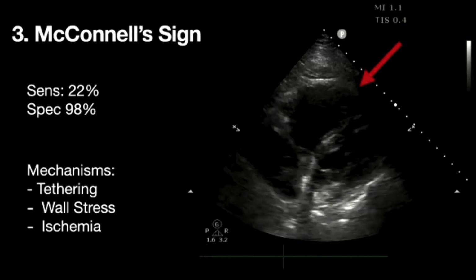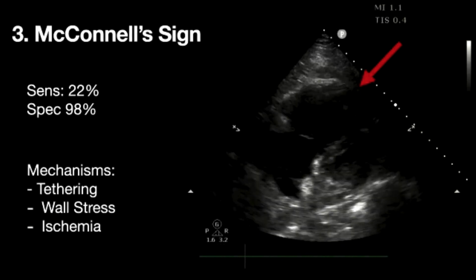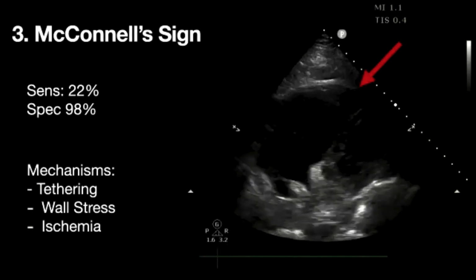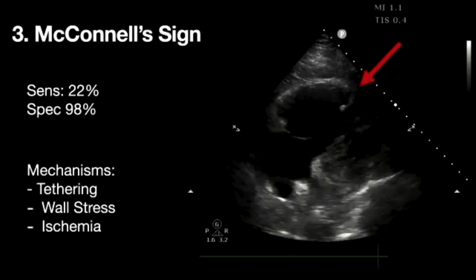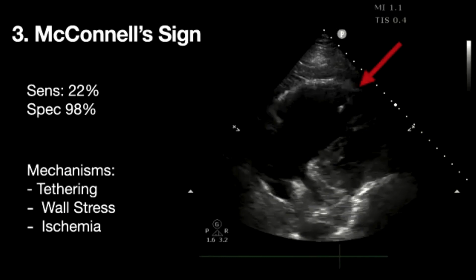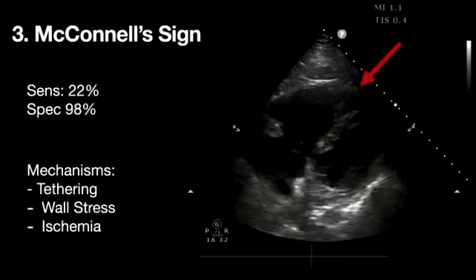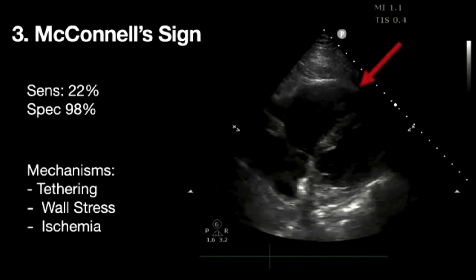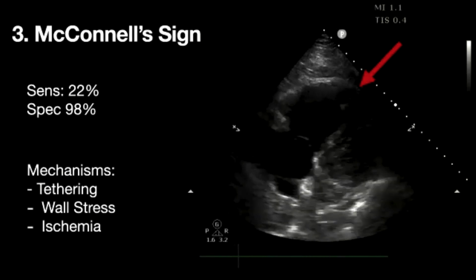Quick mention about how the right ventricular size is assessed in the apical views. There are actually multiple views on which you start assessing right ventricular size. The first one is the parasternal long axis view, which is one of the standard echo views. And you start getting a sense of whether the RV is dilated right in the first image that we acquire. The second was the parasternal short axis view, which is really focused upon assessing the aortic valve and looking for tricuspid regurgitation jets. In that view, you can assess the size of the right ventricular outflow tract and also the free right ventricular size and how the right ventricle contracts.